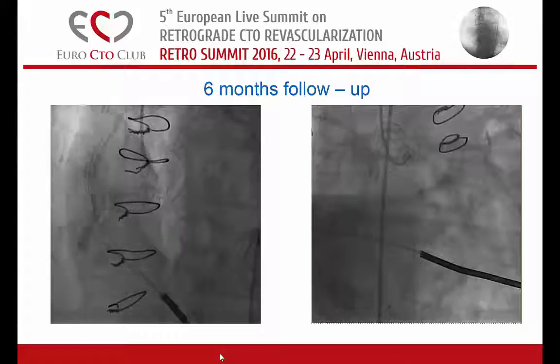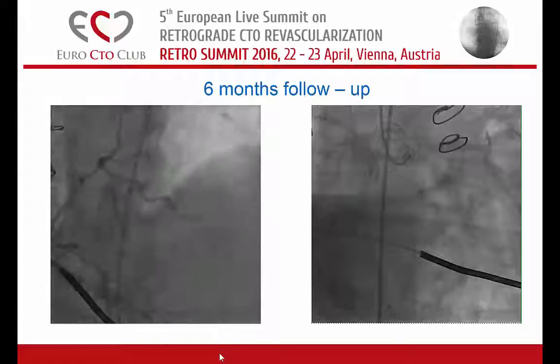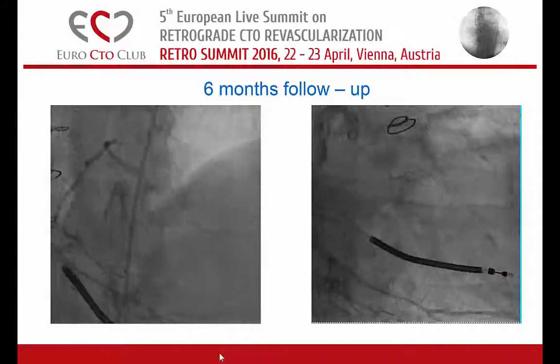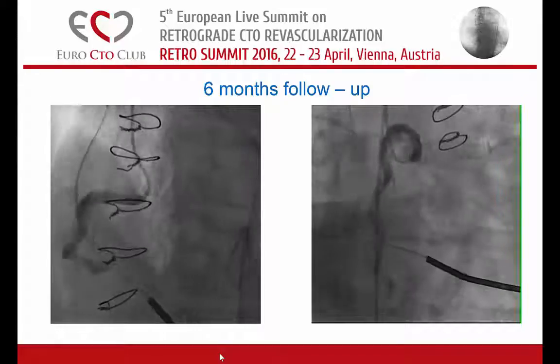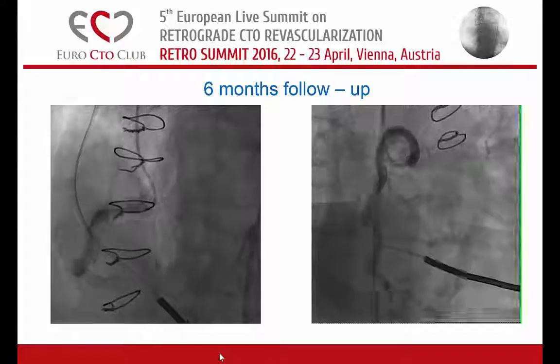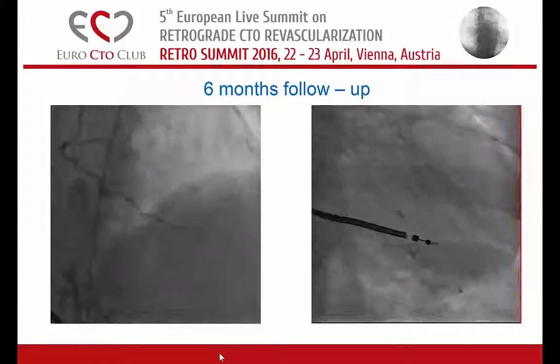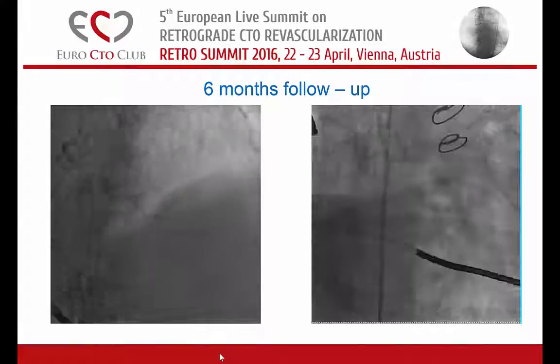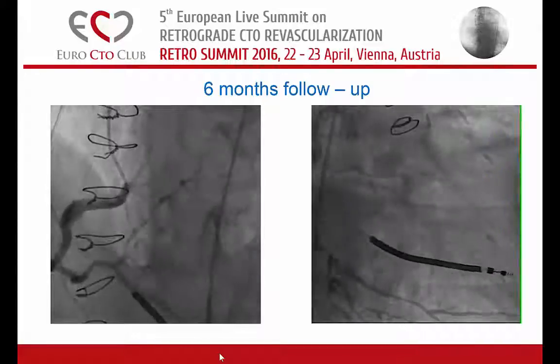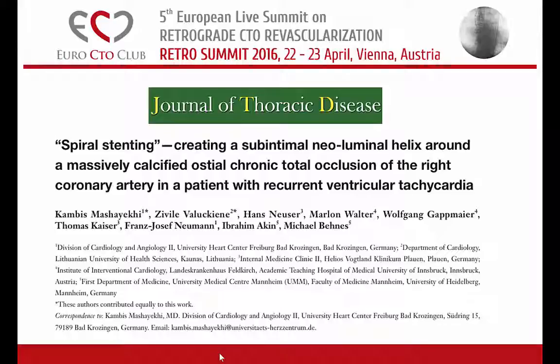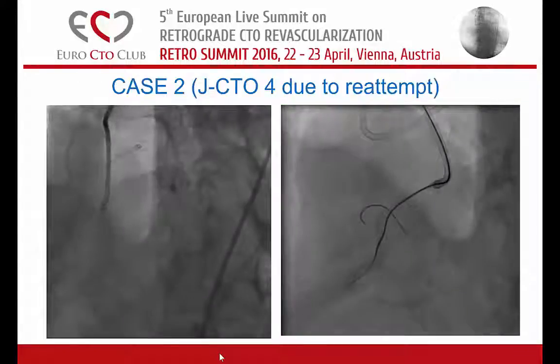This was the final result. We brought the patient back to six-month follow-up — I was a little skeptical regarding this spiral stenting around this calcified RCA. What we could see were some tiny aneurysmal formations and some in-stent restenosis in the mid part. We did FFR and IVUS but there was no ischemia, so we left it as is. Now at two-year follow-up, the patient has no angina anymore and no VTs anymore. We published the case also in the Journal of Invasive Cardiology.